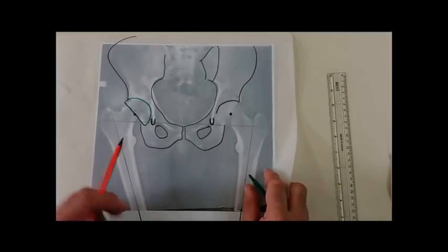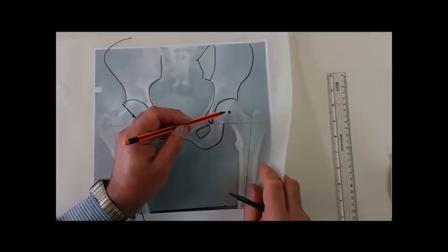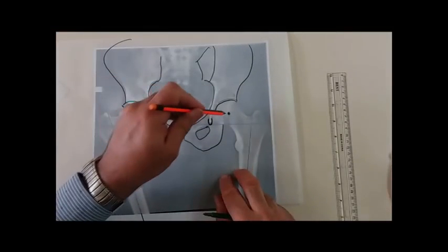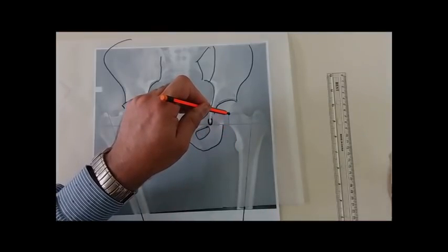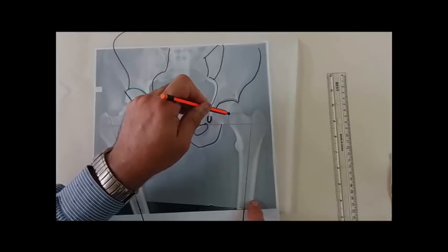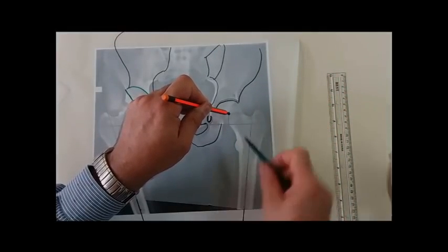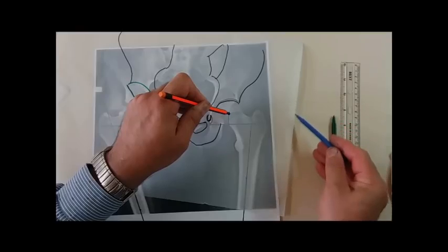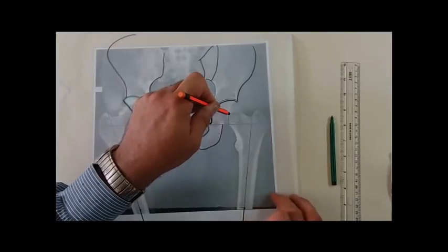I adapt or coincide the center of rotation in the tracing paper with the center of rotation in the radiograph. And I fix the relation of the tracing paper with the radiograph by this maneuver. So the tip of this pencil is on the center of rotation. I will rotate the whole tracing paper in this way and that way, so that the edge of this paper would be parallel to the intramedullary line of the femur. So this is the edge of the tracing paper, and this line is the intramedullary line of the femur.